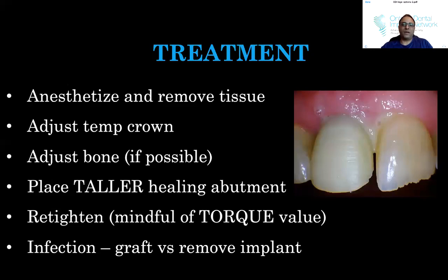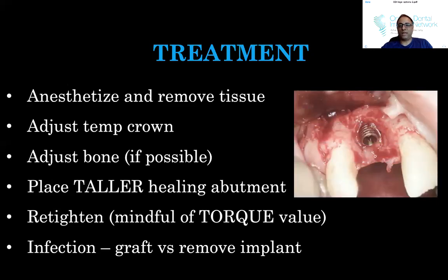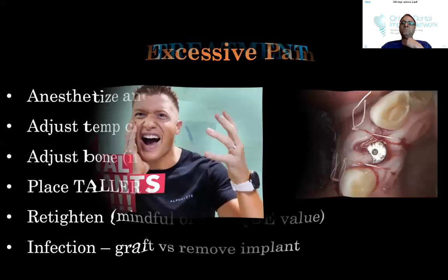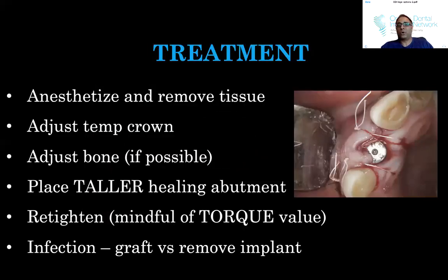You know, for Randy, God bless Randy. He's a great guy. But honestly, he was a pain in the ass. So I had to just take out this. Look at that. The implant. None of the graft took. This is how it looked originally. And all the graft was gone. I took out the entire implant and I replaced it with more graft and just a healing abutment this time. And I told him this is his last chance. So, you know, I show him like 300 cases where everything's been fine except for your case. So it doesn't happen very often, but if it does happen, then you may have to manage it by removing the implant if it gets that bad.